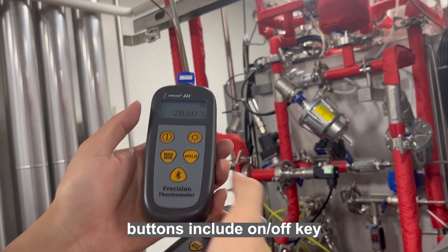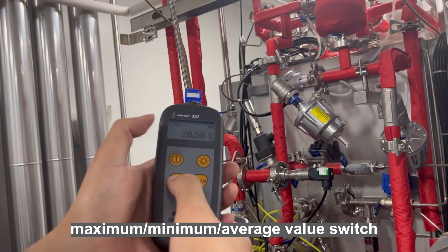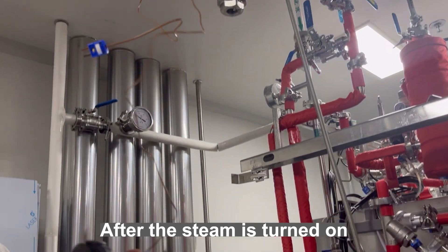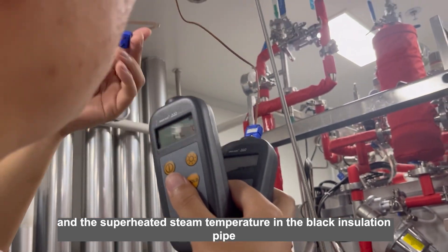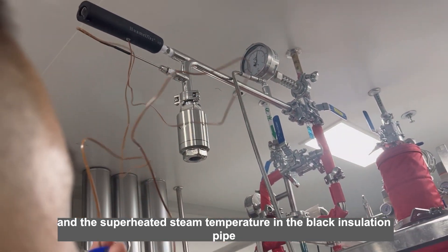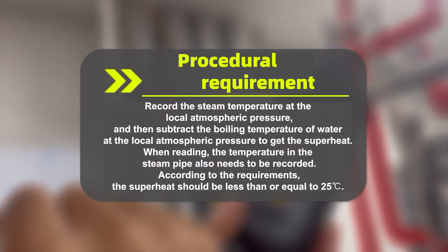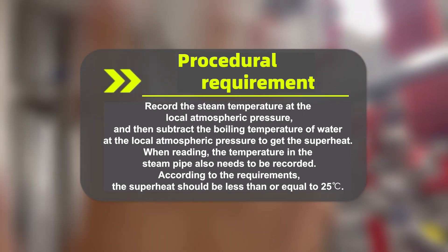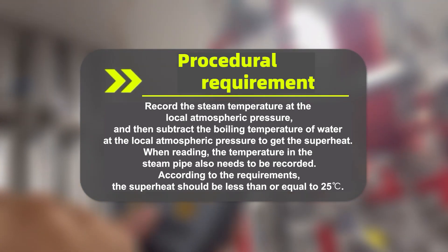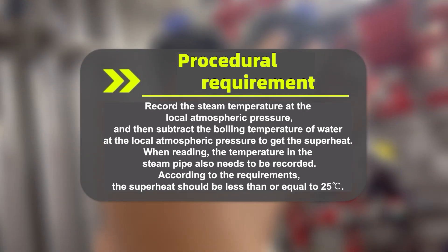Thermometer buttons include the on/off key, backlight, maximum/minimum/average value switch, and lock screen button. After the steam is turned on, measure the steam pipe temperature and the superheated steam temperature in the black insulation pipe. When the temperature in the black insulation pipe is stable, record the steam temperature at the local atmospheric pressure, and then subtract the boiling temperature of water at the local atmospheric pressure to get the superheat. The temperature in the steam pipe also needs to be recorded. According to the requirements, the superheat should be less than or equal to 25 degrees Celsius.